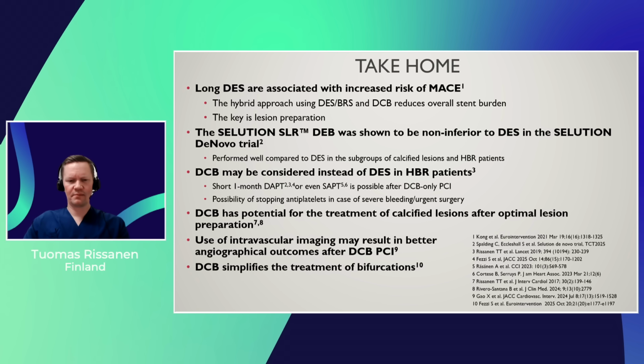And we have to learn more about intravascular imaging, but in practical terms, it helps in sizing the predilatation balloon, evaluation of the lesion characteristics, and also calculating the MLA after predilatation. And in bifurcation, DCB simplifies the treatment.